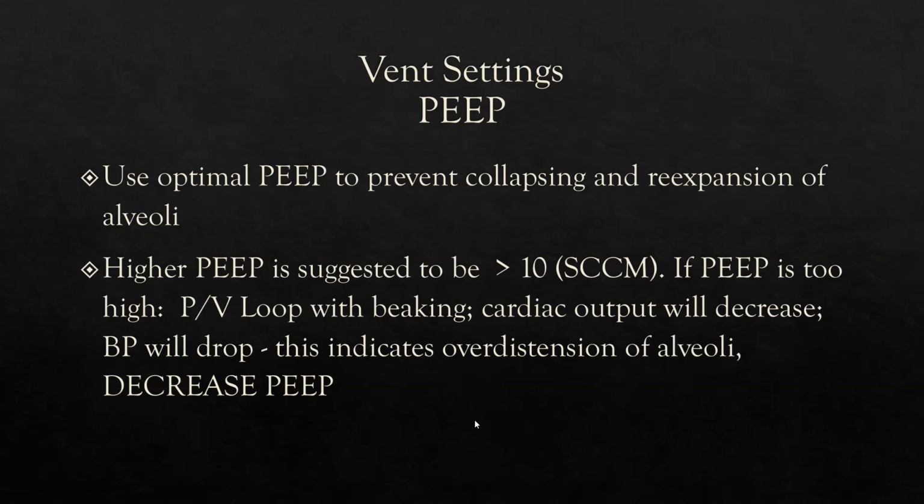And then how would you know if you have too much PEEP being delivered? Peak pressure would tell you if you have too much PEEP. Blood pressure drops, yes. And what did you say? Okay, so once you have the extra PEEP plus a volume, it can over distend the lungs.